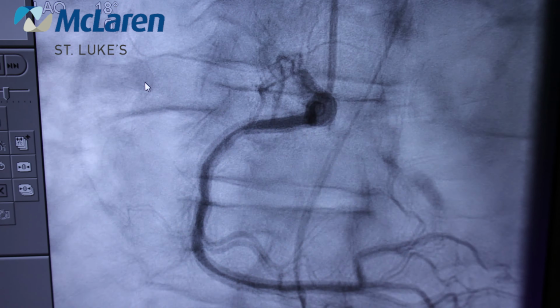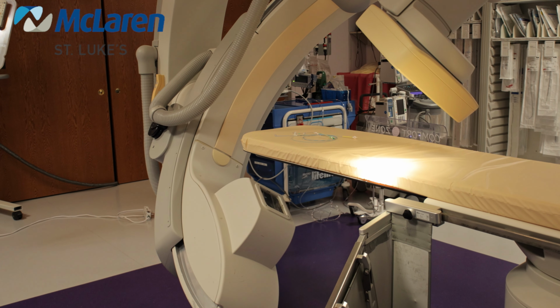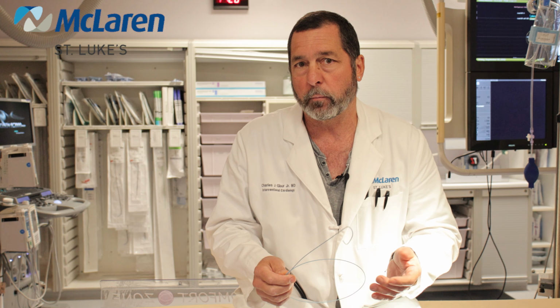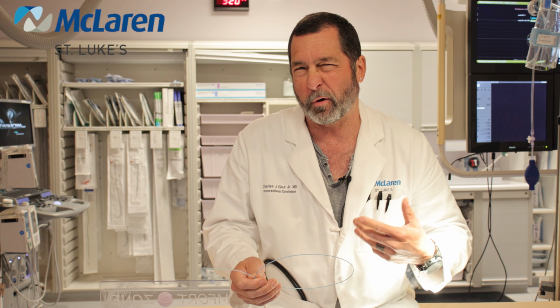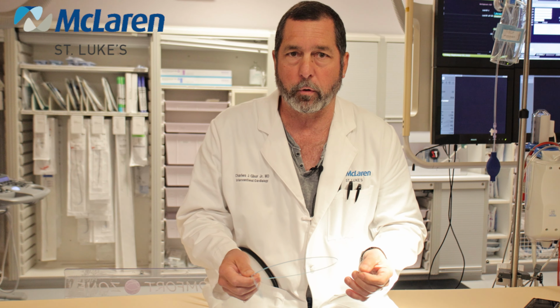And we'll inject dye through these catheters into the arteries, and our x-ray machines will move around you. We'll take several different pictures and different views so that we don't miss anything. Once we're completed, then typically we do a ventriculogram, which is with a different catheter. We inject dye into the ventricle, and you'll often feel a warm sensation. It'll last about 30 seconds and then it goes away. And then the whole procedure takes 10 or 15 minutes unless we have to do more or actually fix an artery.